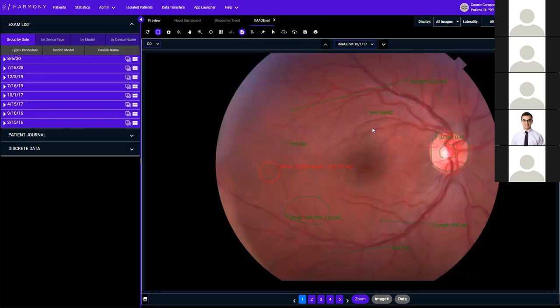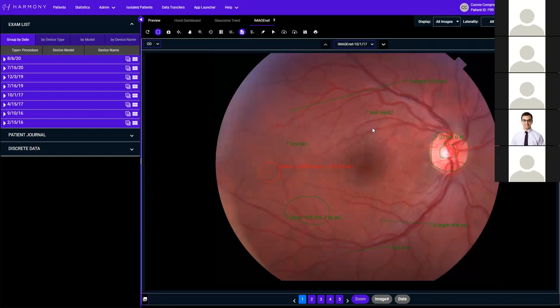Question from participant: In Synergy, I haven't been able to delete an annotation once I've made it — for example a cup-to-disk ratio you drew. Can you remove it? Yes, I'll show you. Unfortunately you can't delete annotations as you go along — you have to make the annotations, then save them. Once you save them, you can go back and delete them. It sounds odd but it's actually not too bad. The second-to-last icon is save annotations. When I save it, I get a little green icon confirming it.